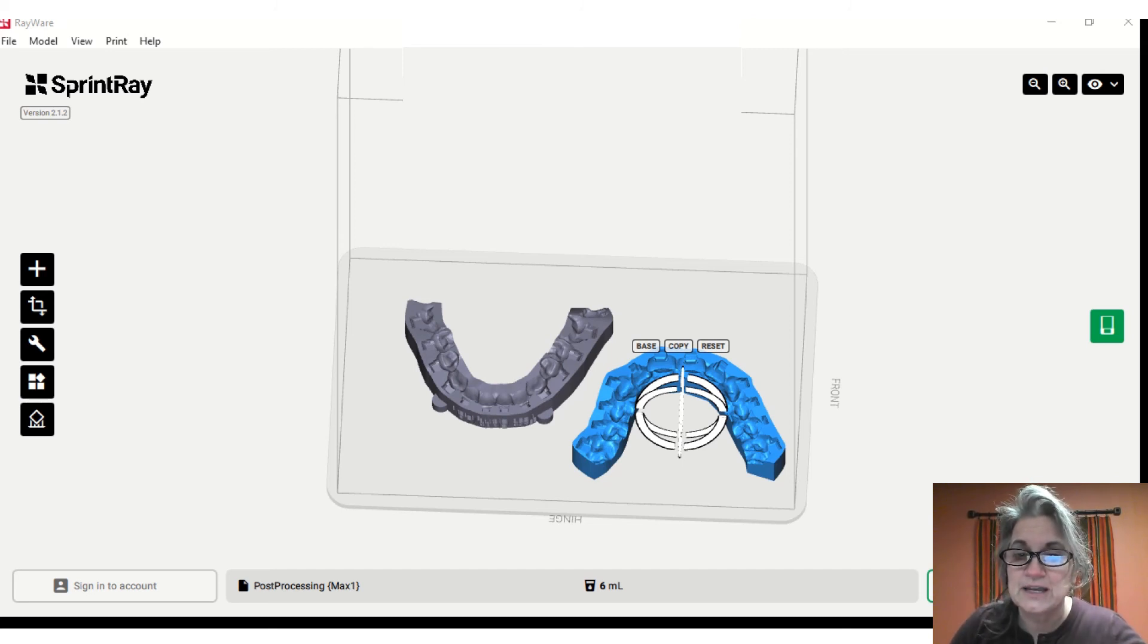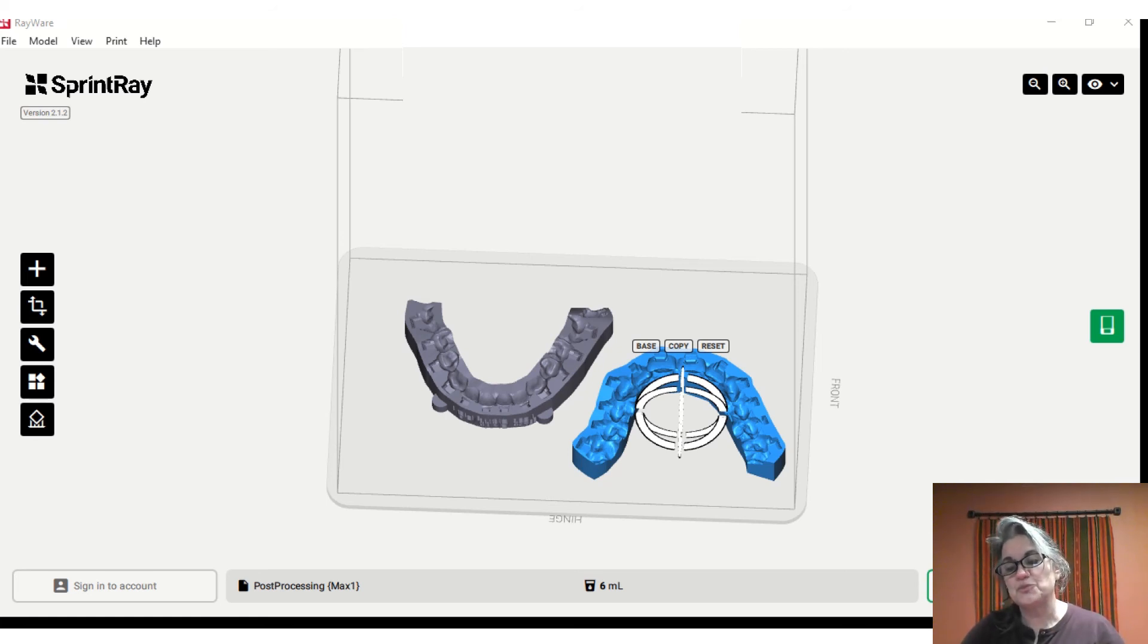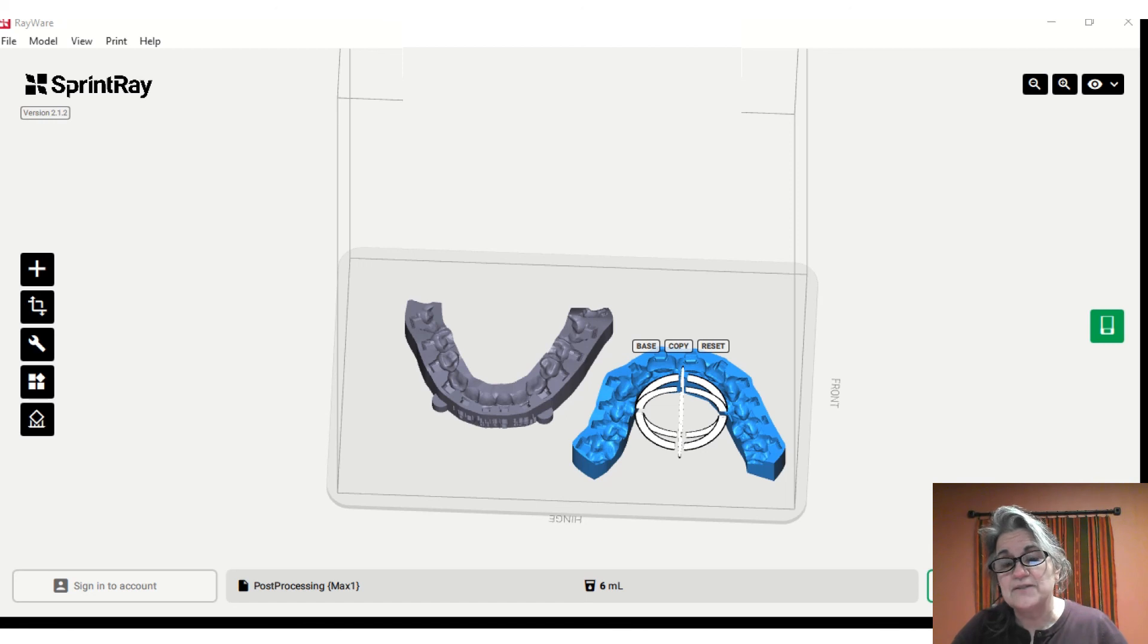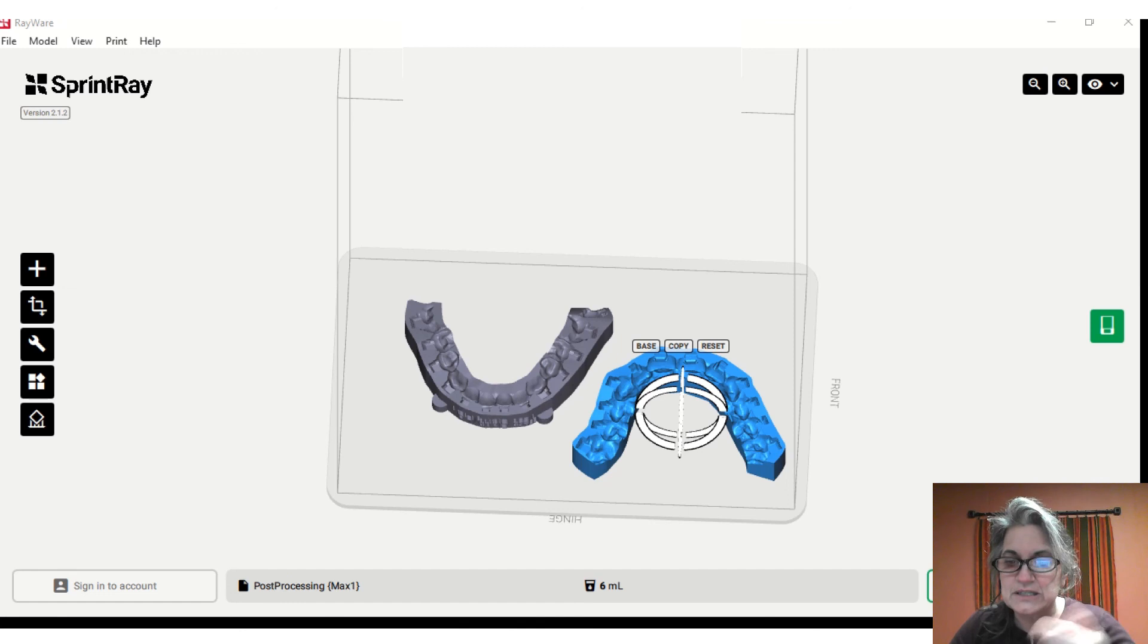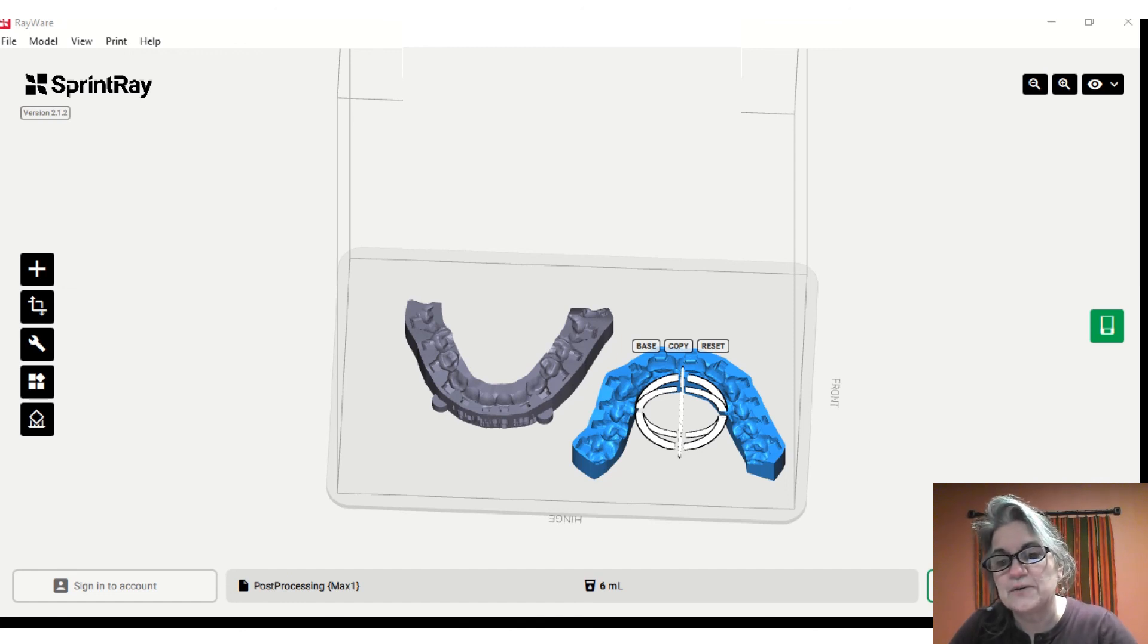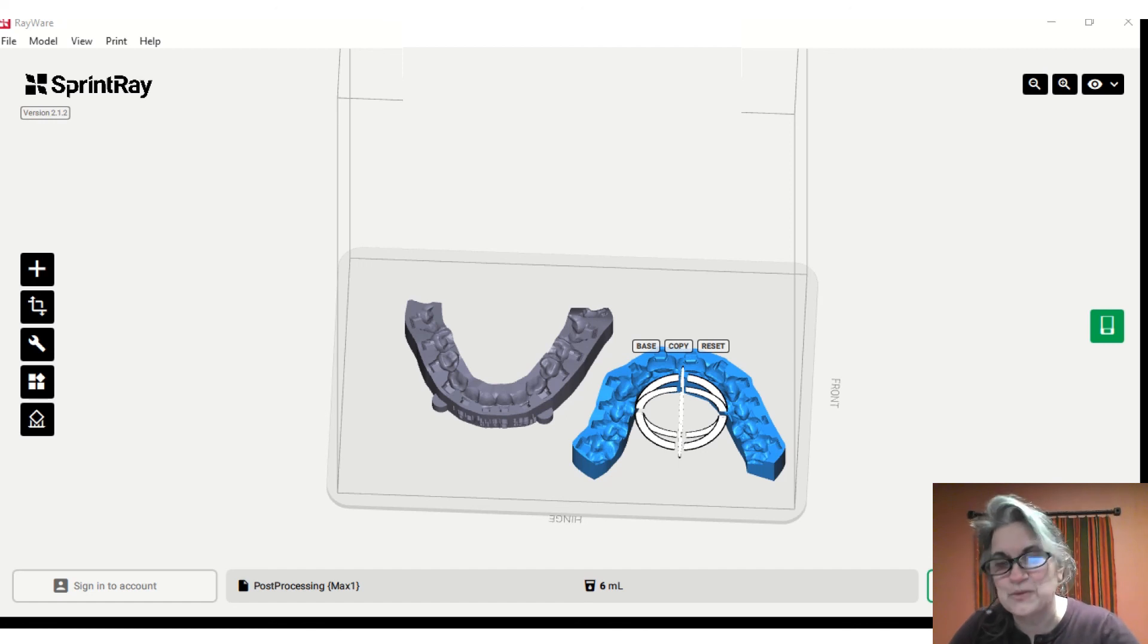As far as print time, if I go at 100 microns you're probably looking at about 45 minutes. If I bump that up - or should I say decrease the layer which would be 50 microns - you're probably looking closer to an hour. Once your print is completed, then you can follow the instructions that we have for post-processing.